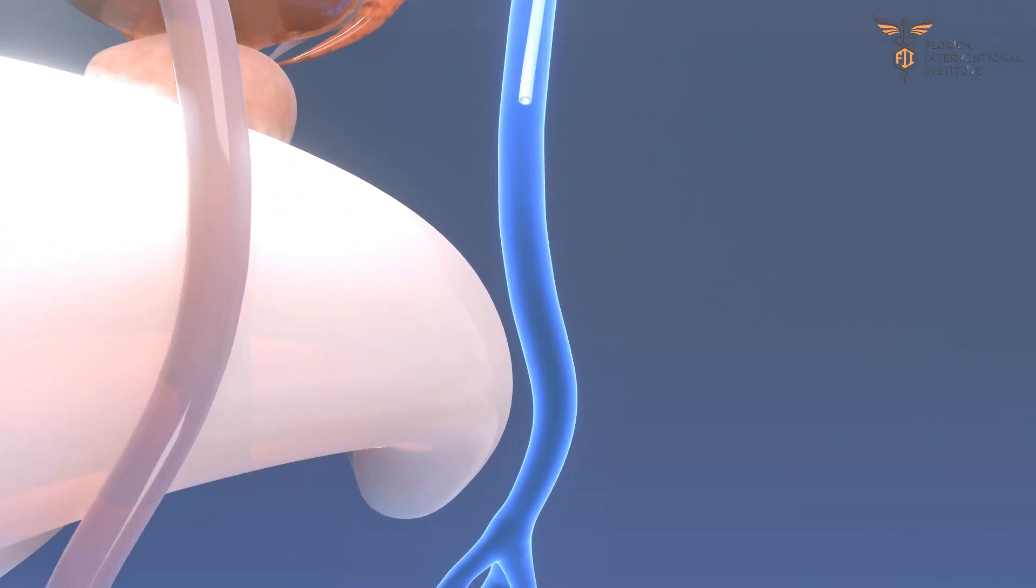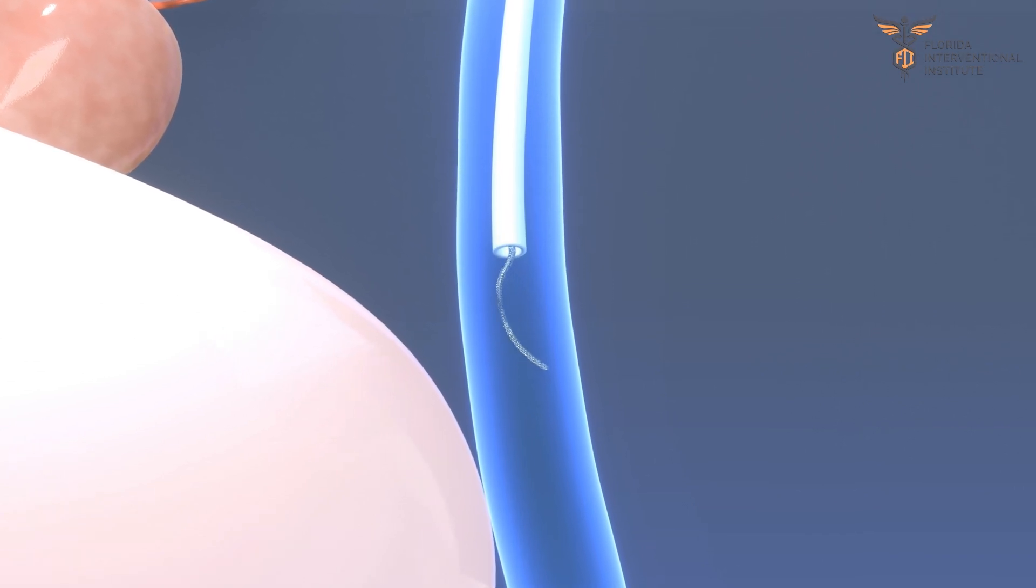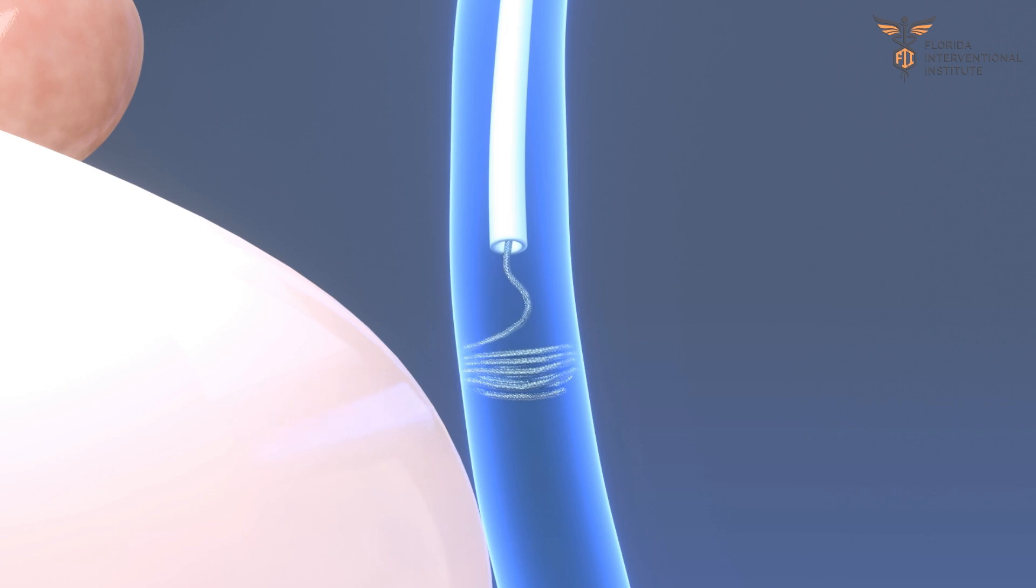Next, a specialized device called a coil is introduced into the vein and is formed in the vein. This coil mass blocks the central channel of the vein and prevents the reversed flow of blood.